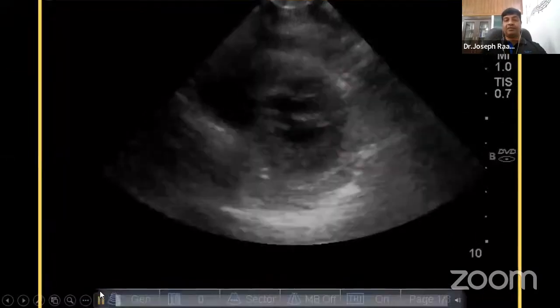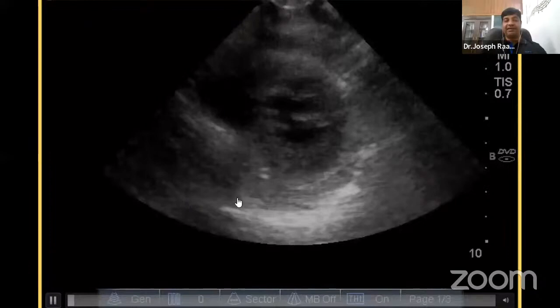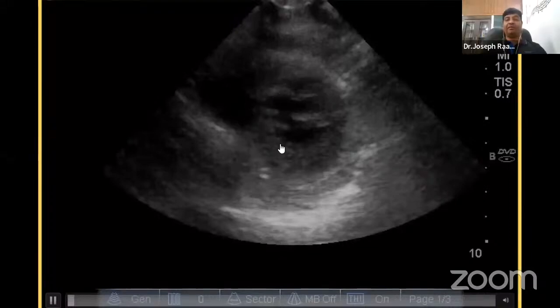What is this view? Are they answering? Yeah, sir. Video is playing. There is no answer in the chat box. Yes, papillary view. Very good. Mid papillary view in the short axis.